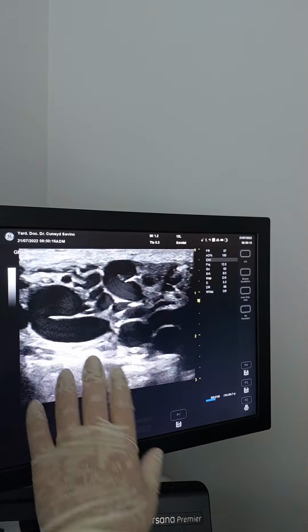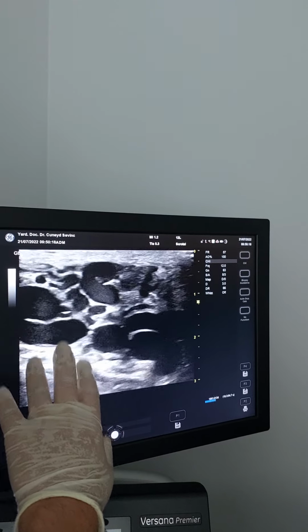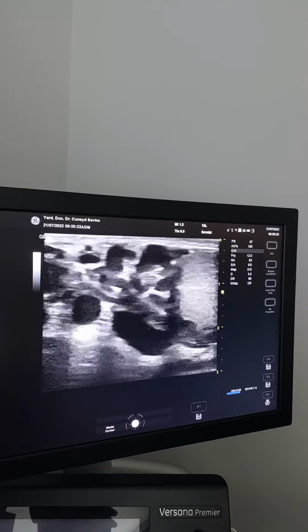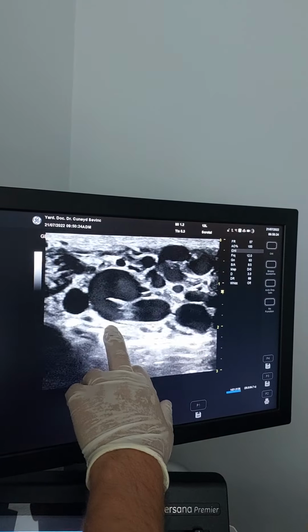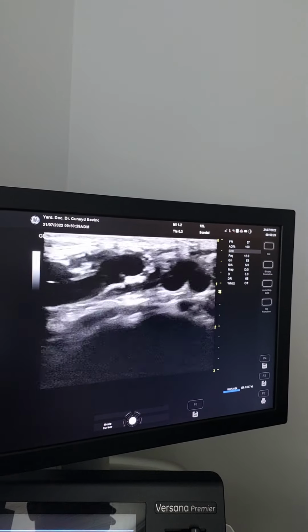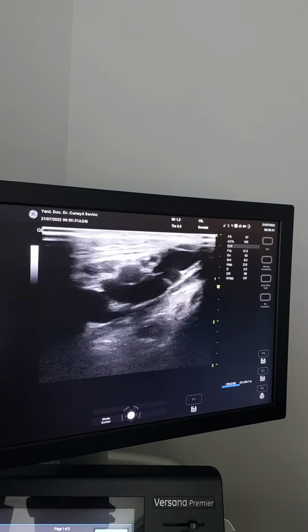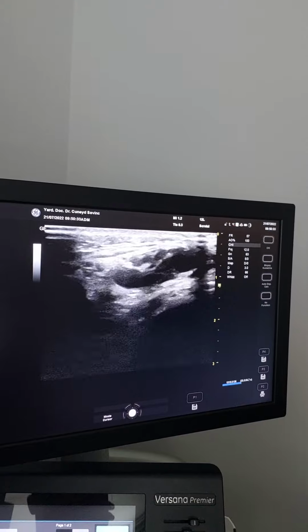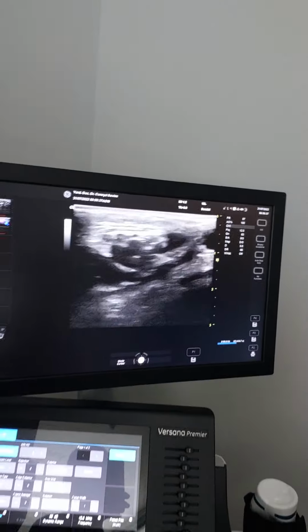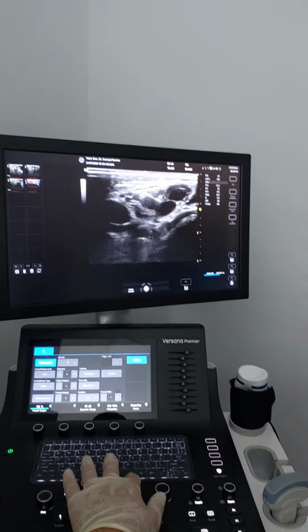In this patient, I will take the photo of these, and then in the operation I will look and say, okay, in this patient I have to find very huge veins like this. So this is one of the most important parts of our technique. We are very experienced in varicocele surgery. It's our main interest. And we examine all patients in such a way with Doppler at the beginning.